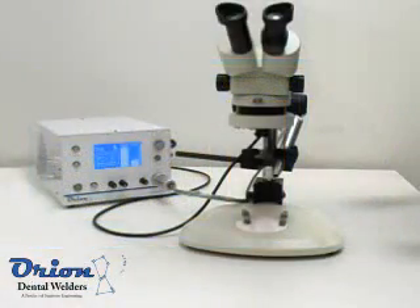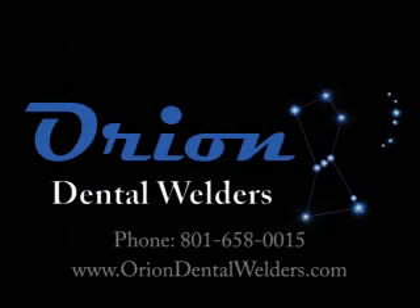The Orion Dental Welder is simple to use, but has the versatility to take on any project. For more information, contact Orion Dental Welders.